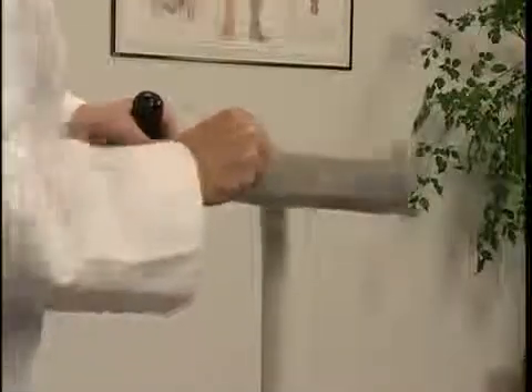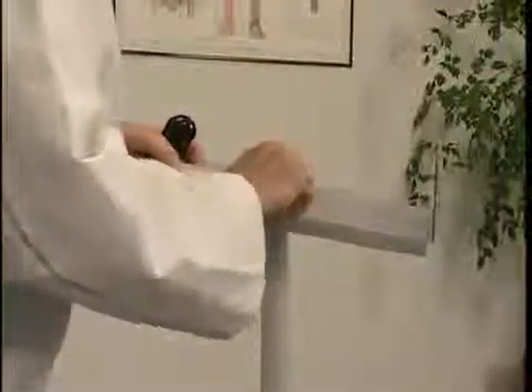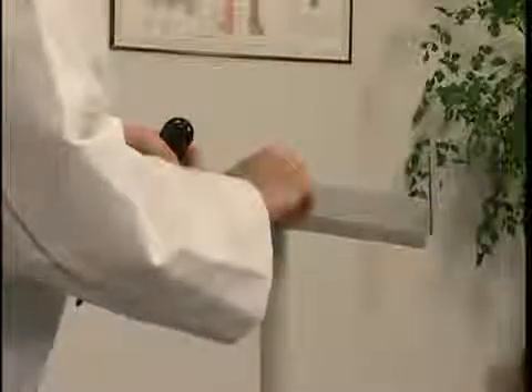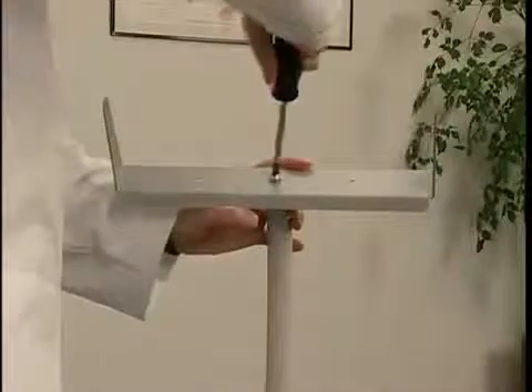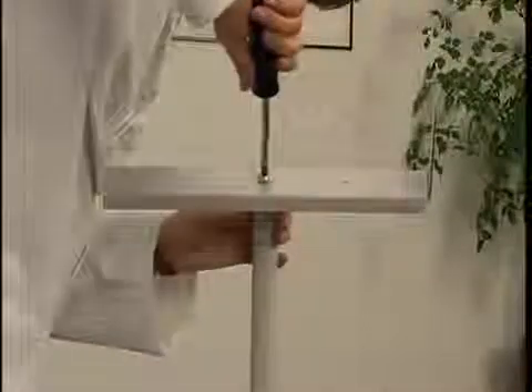Assemble the roll stand using the instructions provided in the shipping box. Be sure to fit the pole's alignment pin through the alignment hole on the bracket. Use a Phillips head screwdriver to attach the mounting bracket to the end of the roll stand's pole.